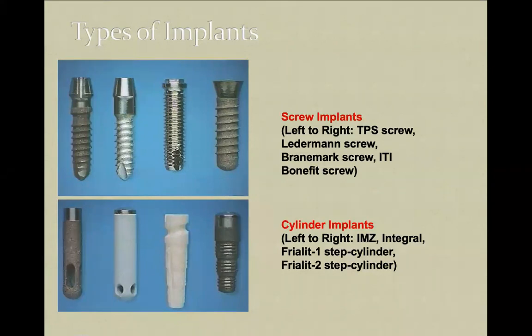The maximum diameter of dental implants in most implant systems is 6 millimeters. Yeah, this is the maximum diameter. Usually, the standard for implants is 3.5, 3.75, 4.0, 4.2 in diameter, and the length between 10 and 13 millimeters. This is the most useful kind of dental implant in daily clinical practice.